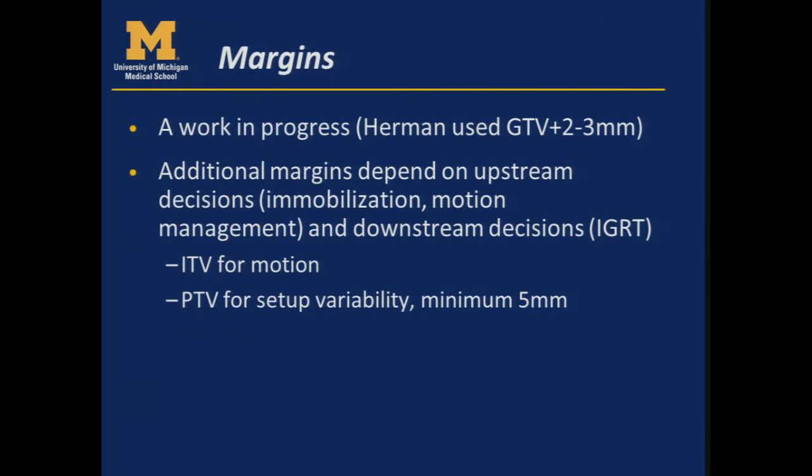So margins for SBRT. In the multi-institutional study, Joe Herman and his collaborators used a GTV plus 2 or 3 millimeters. I'd say it's really a work in progress, and should usually be done in a clinical trial again. Any additional margins really depend, just like in the liver, on any of the upstream decisions that you made about immobilization and motion management.